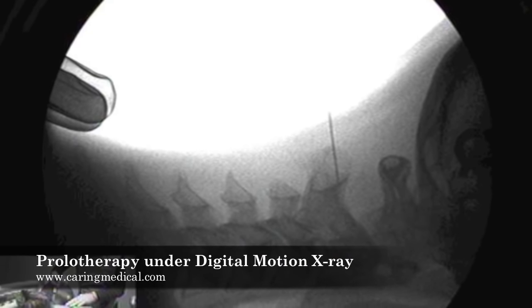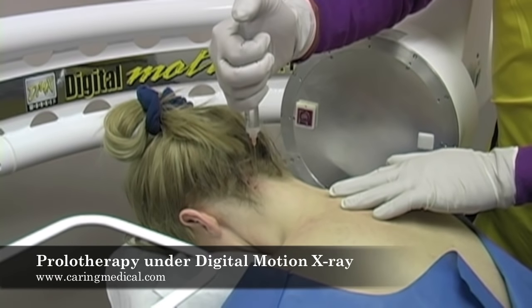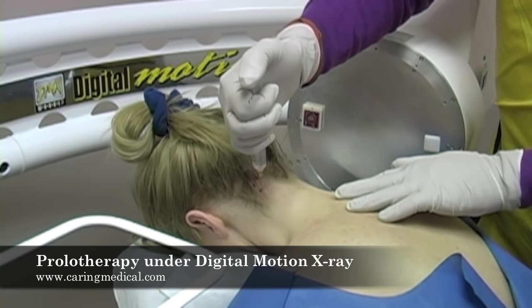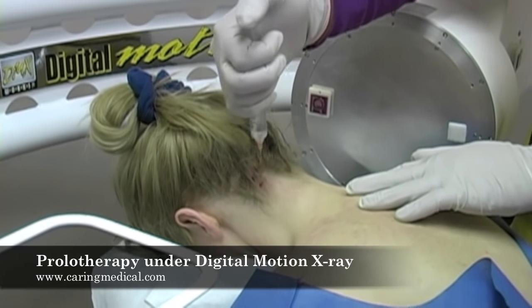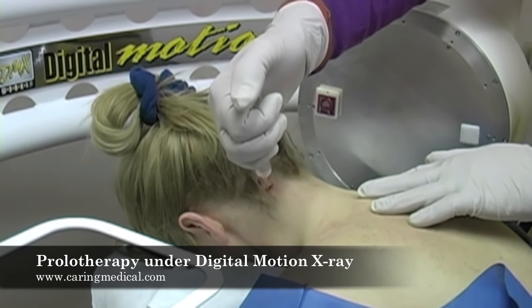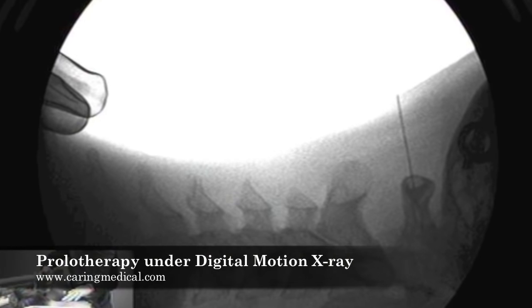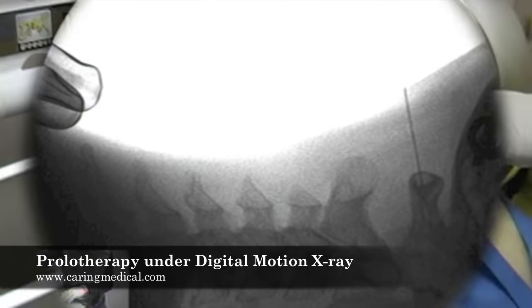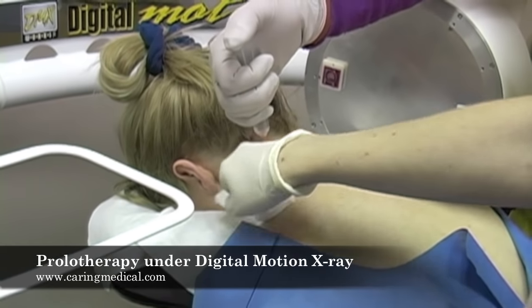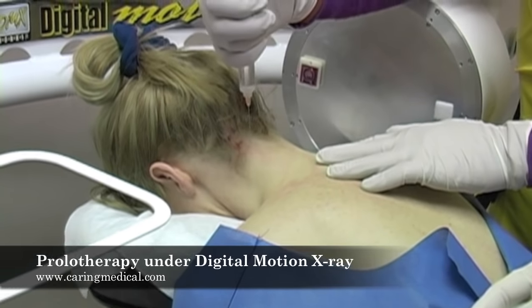In this next clip you actually see what I see. There I'm on the C2 vertebrae, so you can see that it's very easy to put the solution right onto the C1 and C2 area. Prolotherapy under fluoroscopy can be very effective, especially at helping the very difficult cases.